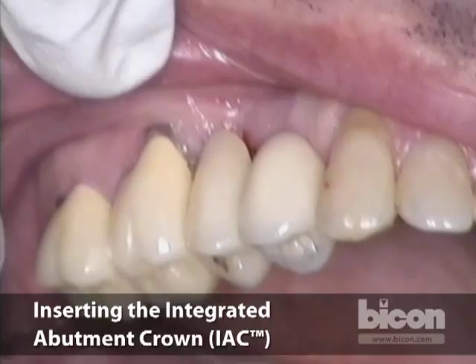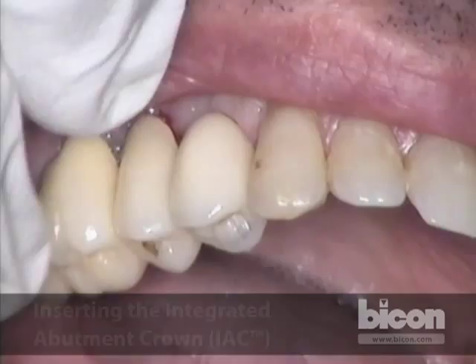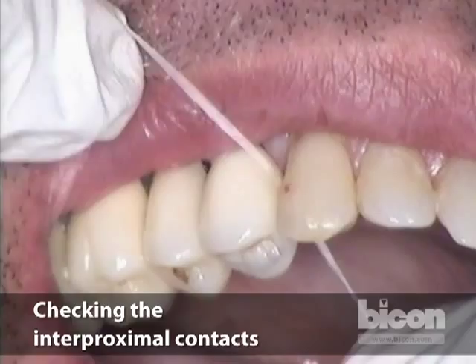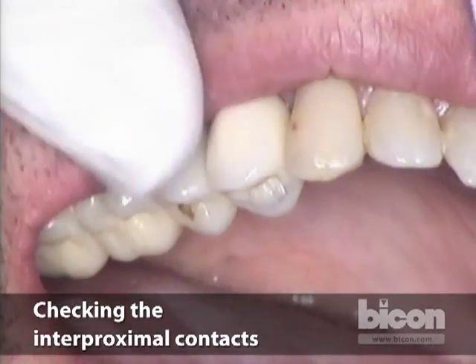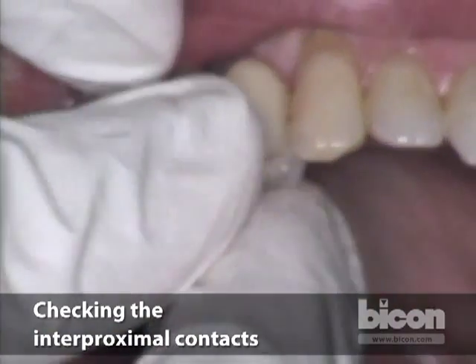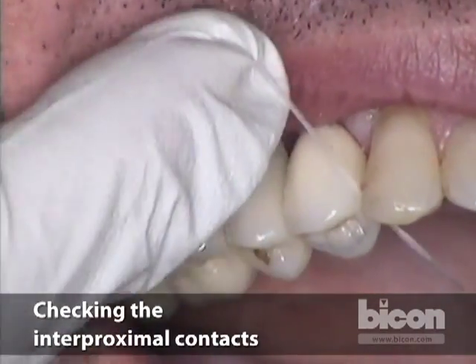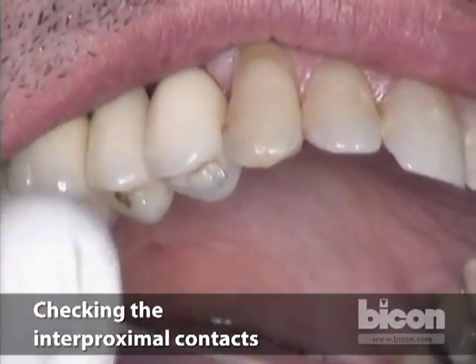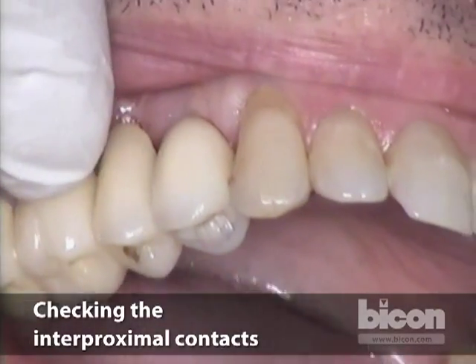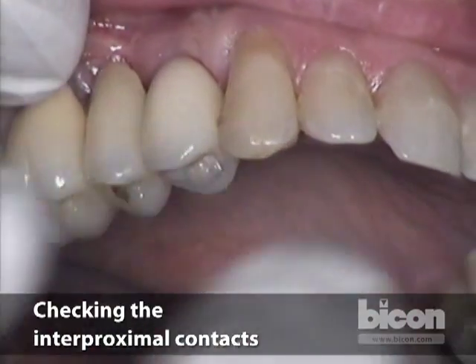We press it and rotate, and then we're going to check interproximal contact. The distal one is tight, whereas the mesial one is open. So I am going to rotate the crown — you can do this manually or use the same instrument. Now I have a mesial contact as well as a distal contact. They seem to be pretty good.